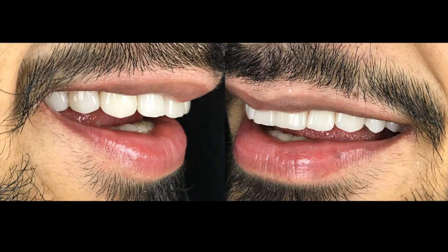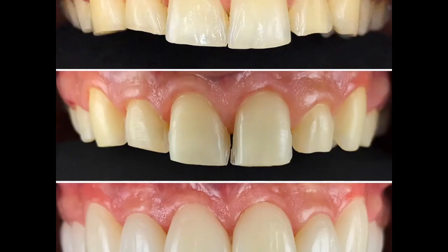I would like to thank here Finish Line Dental Lab for this very nice job. Here the case before cutting, after small non-invasive, really non-invasive, small thin finish line, and here is the case after the cementation session.